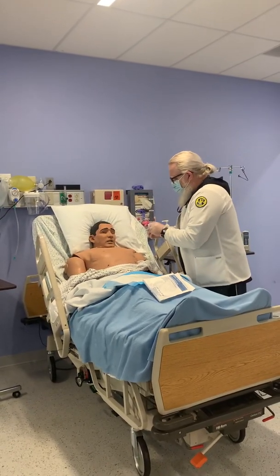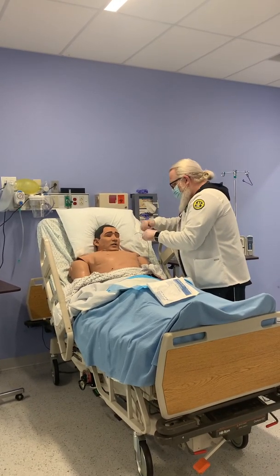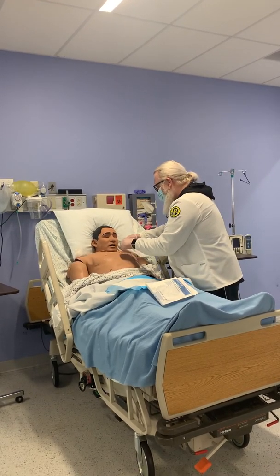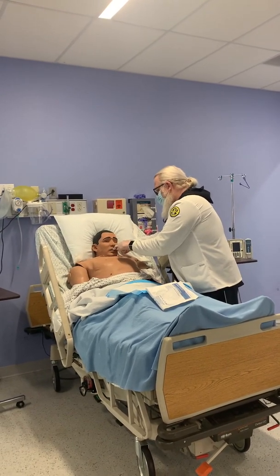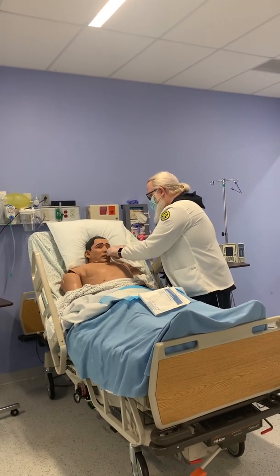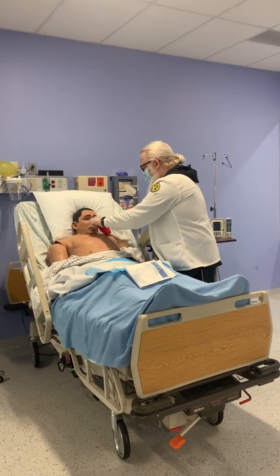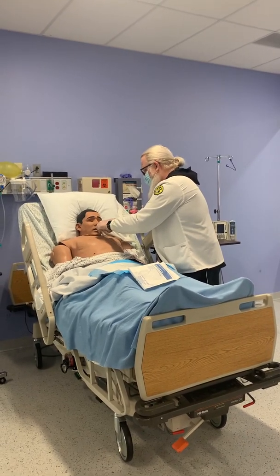Now, what I'm going to ask you to do, I'm going to insert it a little bit, and you might feel some resistance. I'm going to have the water here for you to take some sips, okay? So we're going to begin. I'm going to go straight back towards the ear to advance the catheter. Keep advancing, keep advancing. In the nasopharynx, I have some coughing, so I'm going to ask you to tilt your head forward, have your water here, take some sips, sip, sip, sip. And advance it further. Good.